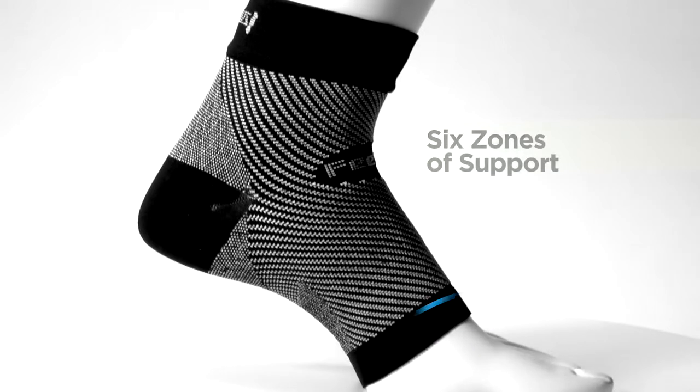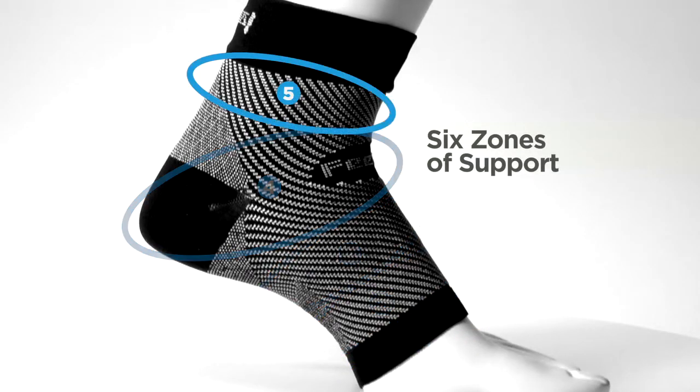Our plantar fasciitis sleeve features FS6 compression zone technology. It provides six zones of support to reduce heel and arch pain by lifting, stretching, and stabilizing the plantar fascia.